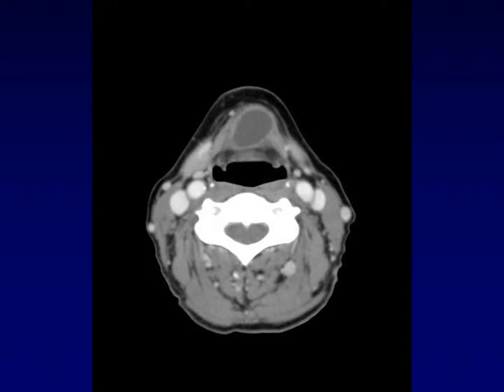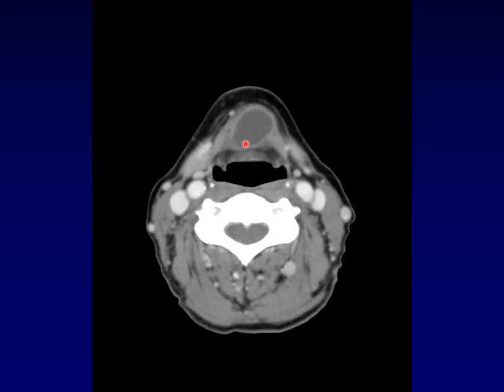Here's a classic example of a thyroglossal duct cyst below the level of the hyoid bone. It is a smooth-walled cystic structure. These can become more complex if they get repeatedly infected, but usually they are thin-walled, and it is embedded within the left strap muscle. So a midline mass embedded in the strap muscle, purely cystic — a classic appearance for thyroglossal duct cyst.